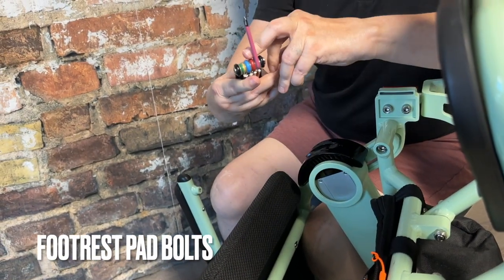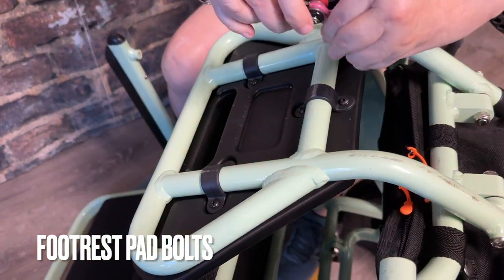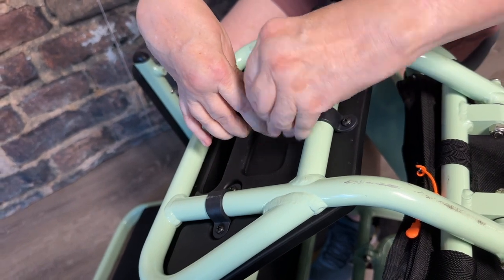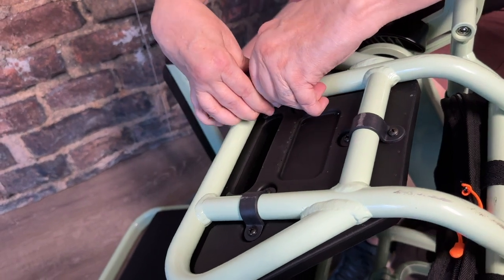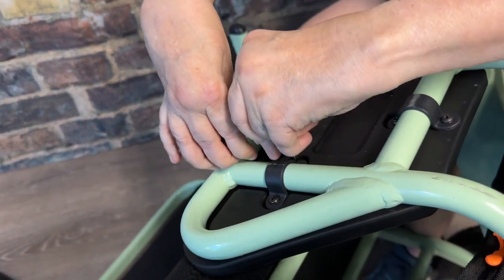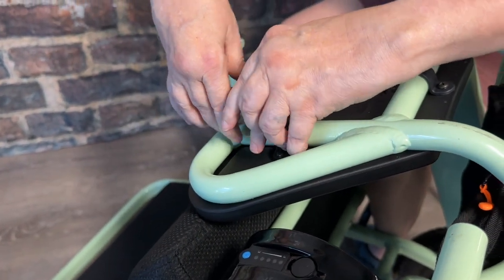With the chair still in the wheelie position, it's now time to tighten the footrest pad. There are three straps and each strap has two screws — six bolts total. Continue using the Phillips head pink tool from your Fold & Go tool kit. If your footrest pad becomes crooked, this is the time to realign it onto the frame. This also acts as the little front bumper for your wheelchair.